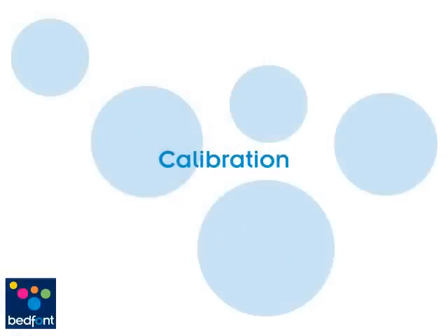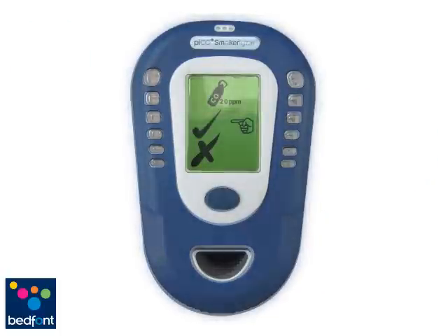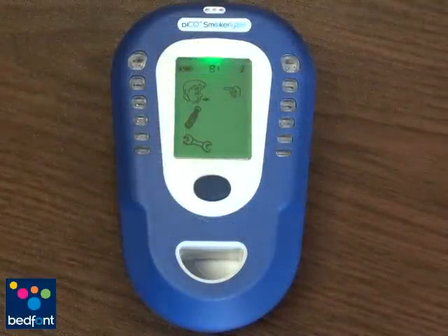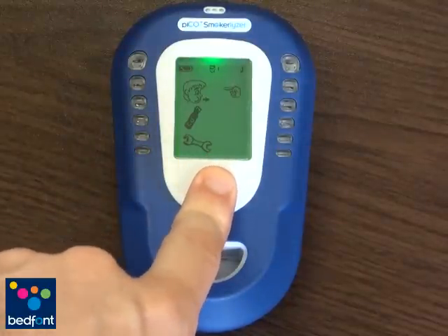The monitor will remind the user that it needs to be calibrated every 6 months. If your monitor is due its 6 month calibration, it will display as shown here. Double click the tick indicated on the screen of the PicoPlus by pressing the blue button twice. If you are manually calibrating the PicoPlus, you will find the calibration settings by scrolling down to the cylinder icon by single pressing the blue button and selecting it with a double press.